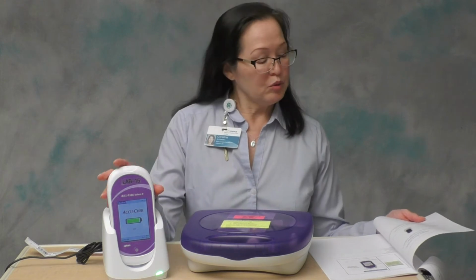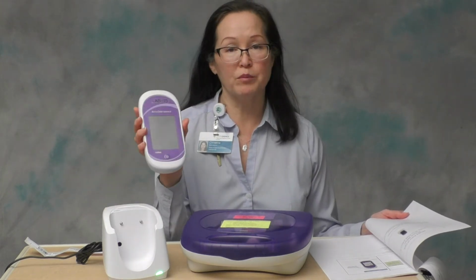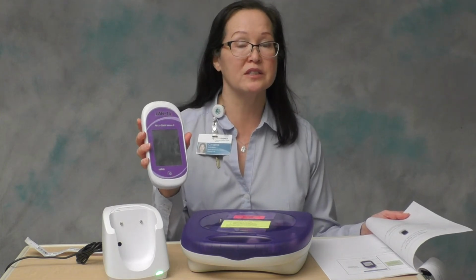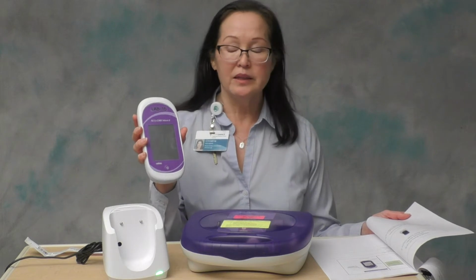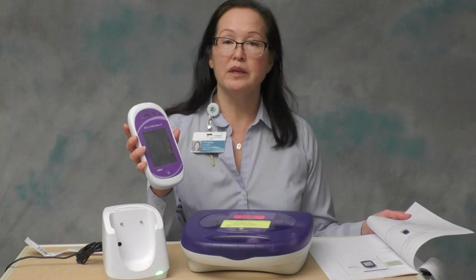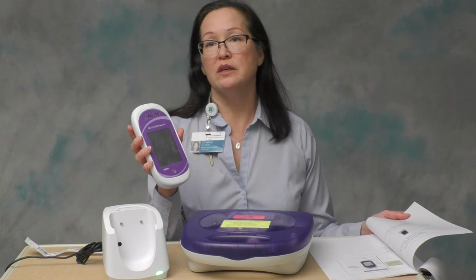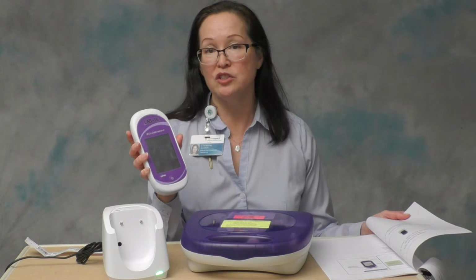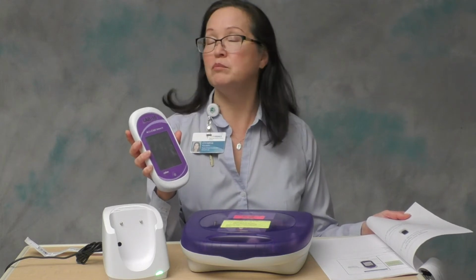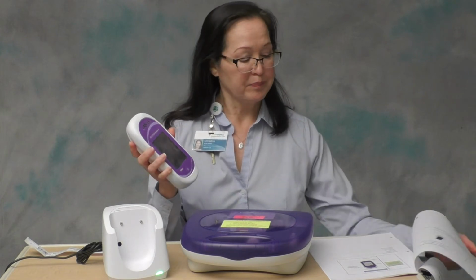So we'll go on to the instrument itself. In our hospital, we use the Roche Accu-Chek Inform 2 glucose meter. We do over 200,000 patient tests a year with this meter. This test is performed in all departments by nursing, except in surgery, where it's just the anesthesiologists and the anesthesia techs that perform testing. And in the emergency department, the ED techs also perform testing.